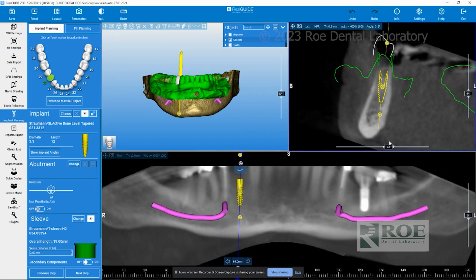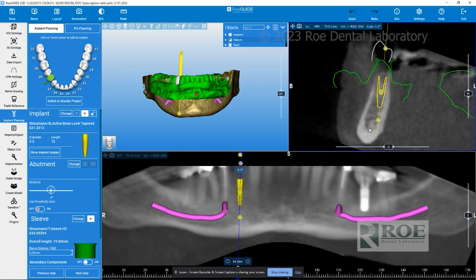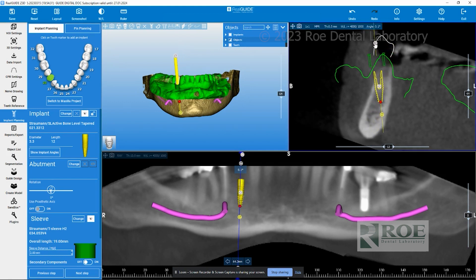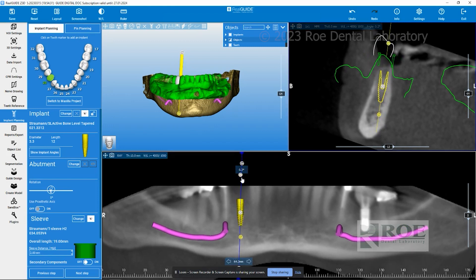If you want to make changes to the implant — be it mesial-distal or buccal-lingual — you'll see two circles on either side of the implant, as well as down on the pano. They're the same color as the implant. Click and hold your left mouse button: one circle moves the apex of the implant, and the other moves the coronal. In this view it moves buccal-lingually, and in the other view it moves mesial-distally.